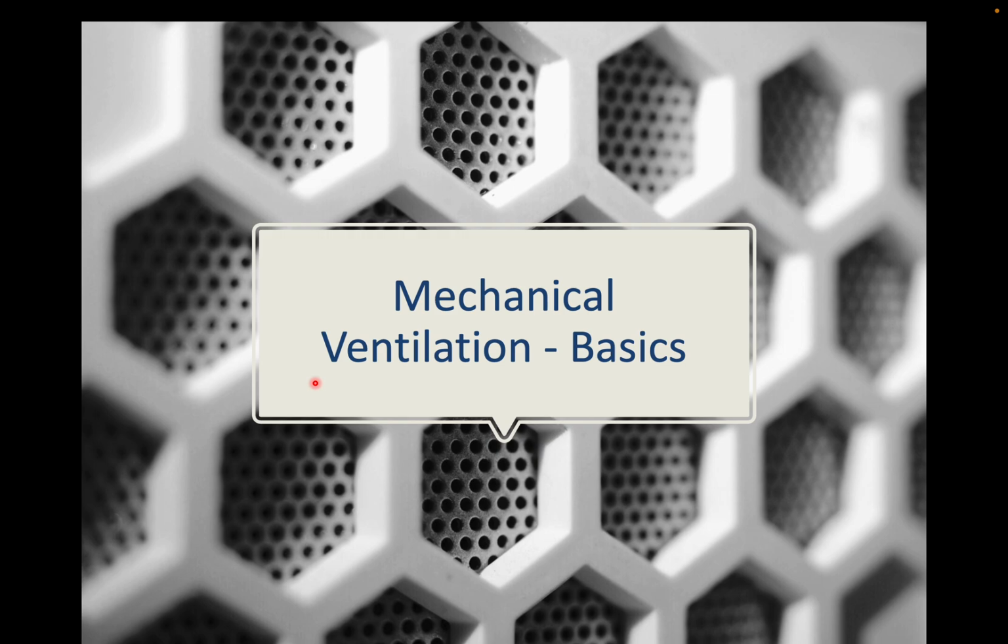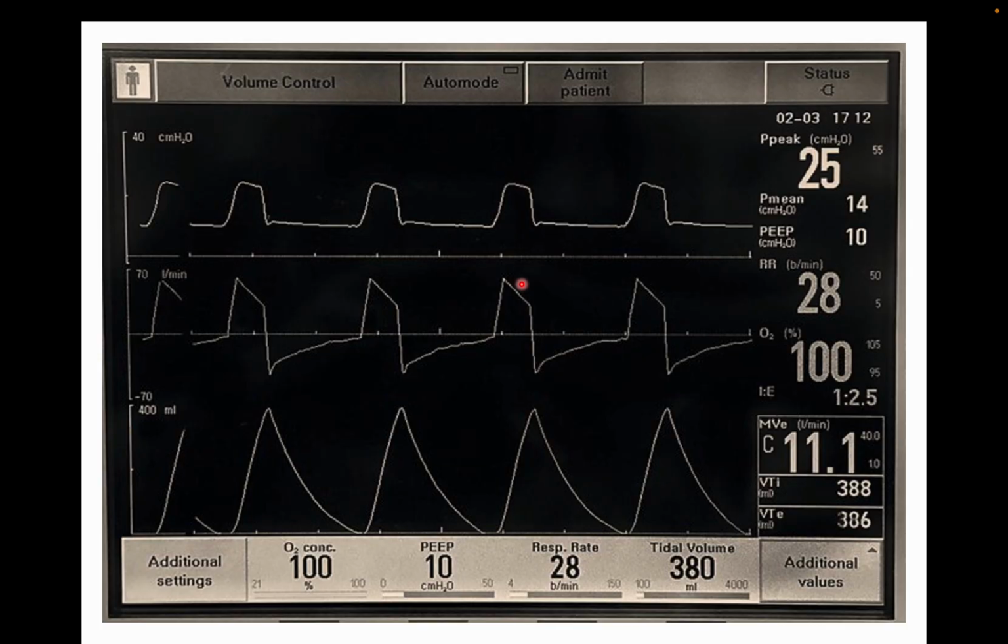What is NIV, what is invasive ventilation, what is volume control, what is pressure control, and also what settings we need in different diseases, we'll learn in this. Before going into the discussion, this is a screen that scares us a lot: how to change all these settings, what are all these loops.